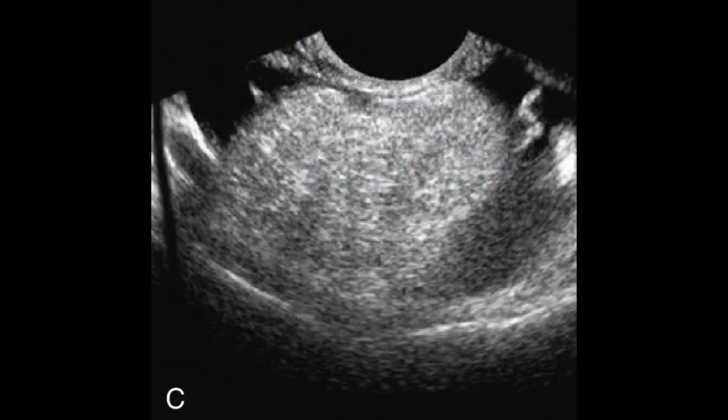But if there are bowel contents and intraluminal fecal contents, it will give rise to the same appearance. It's quite difficult on the transabdominal scan. For that reason you need to have the transvaginal scan. On the transvaginal scan it would be easy for you to confirm.